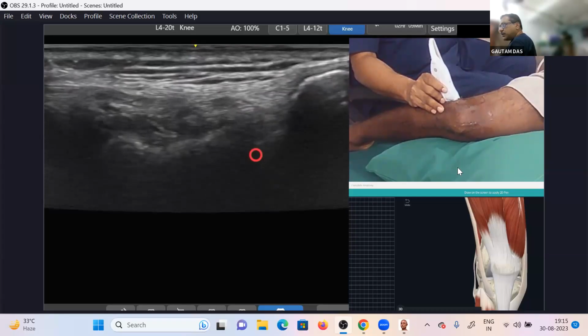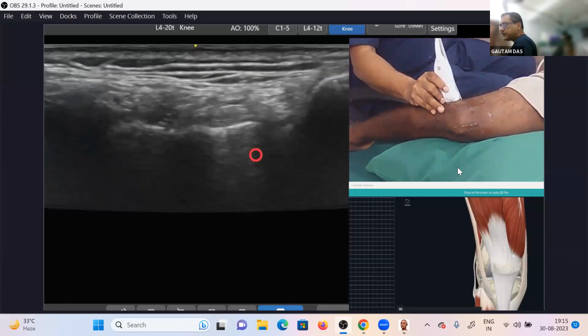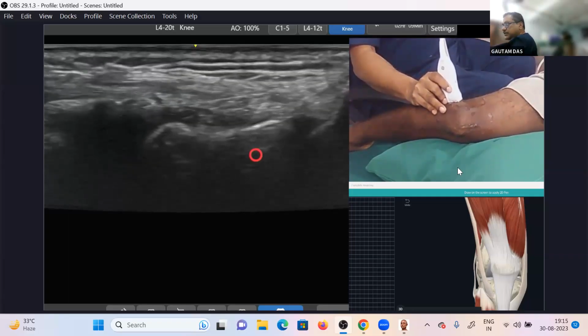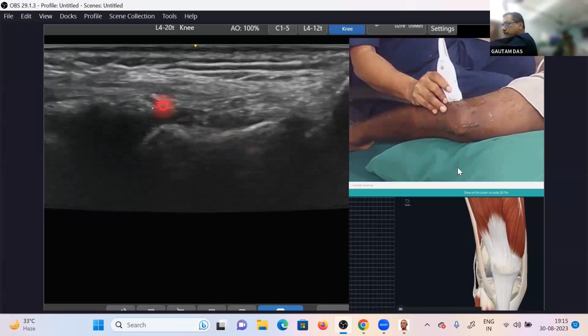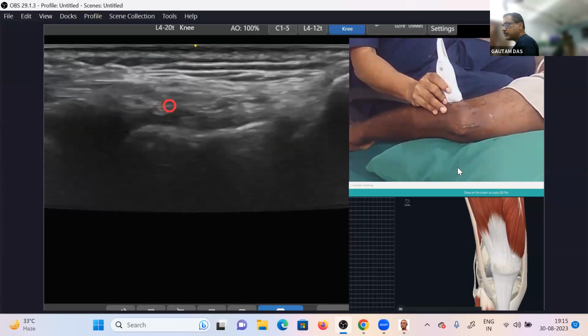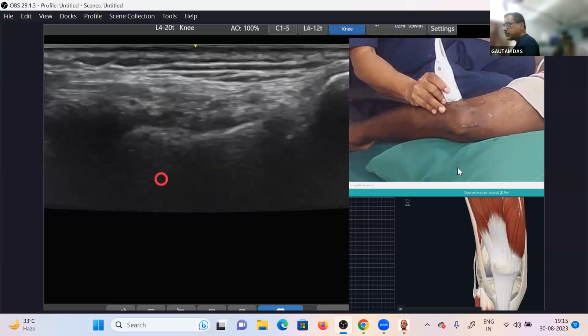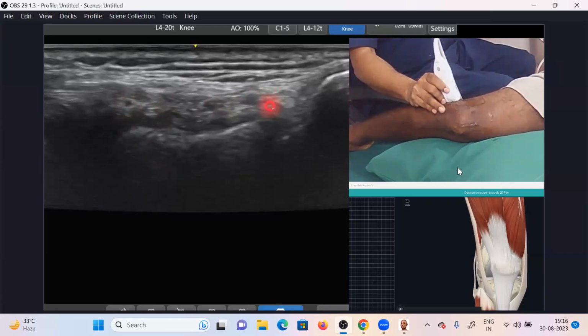Okay, very small artery, and it will be accompanied by the nerve. So this is one nerve, and another nerve will be there. This is easy to find out. Here is the artery, and here is a nerve. That is your lateral retinacular nerve. This is the artery, and distal to that is your lateral retinacular nerve. Can everybody appreciate these two nerves? This is better seen, and yes, this is a small artery accompanied by the nerve.